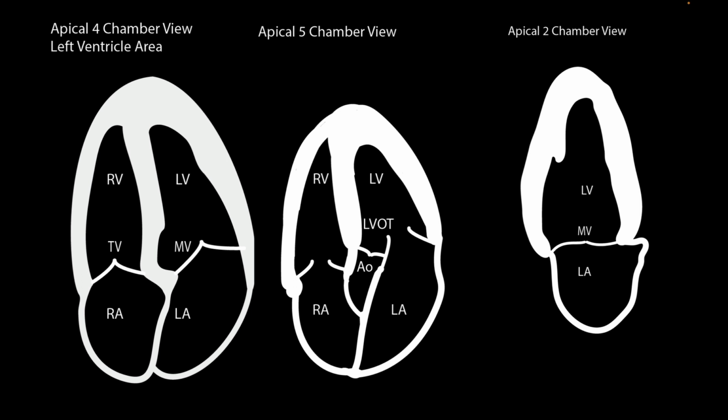That's called the apical 2-chamber view, which we don't use a lot in point of care, but this is the view that we use for doing estimation of ejection fraction when you use Simpson's biplane. So not something that you need to know for point of care, but good to be able to do all the same, just so you understand what those reports mean.